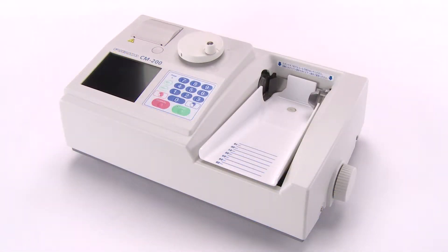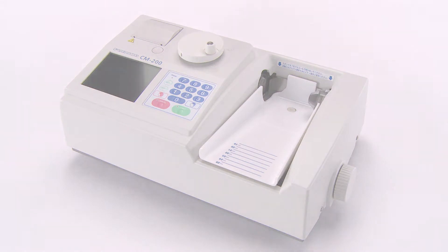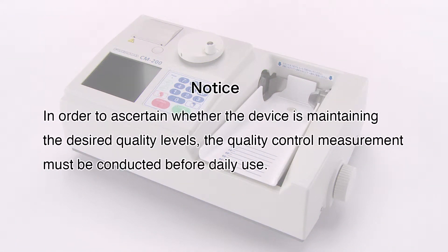Next, we will explain the quality control measurement. In order to ascertain whether the device is maintaining the desired quality levels, the quality control measurement must be conducted before daily use.